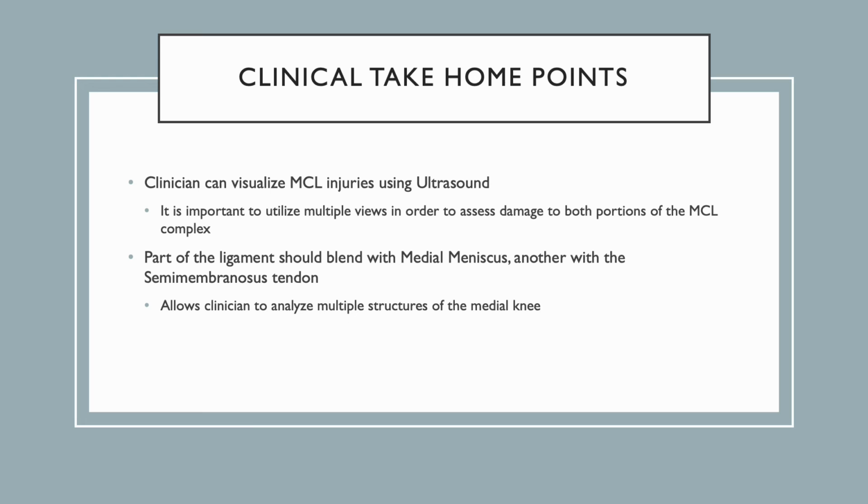Clinical take-home points: you can visualize the MCL injury using ultrasound, but it is important to utilize multiple views in order to assess damage to both portions of the MCL complex. As we've seen, the deep MCL is hard to visualize in the longitudinal view, so a transverse view is always needed. Part of the ligament should blend with the medial meniscus and another with the semimembranosus tendon, so this will allow clinicians to analyze multiple structures of the medial knee in one assessment.